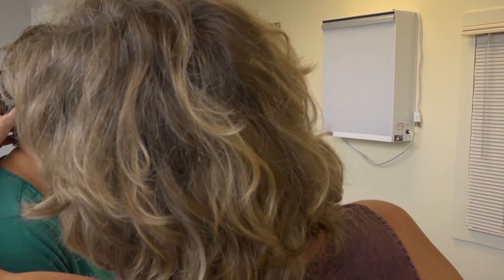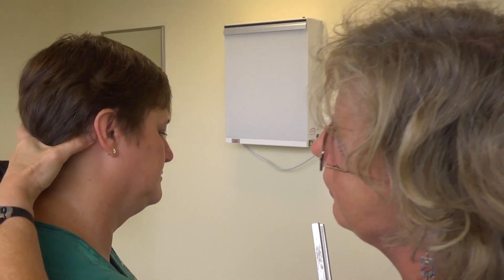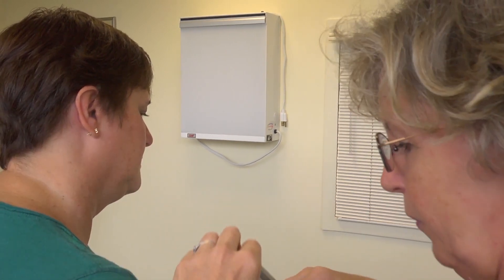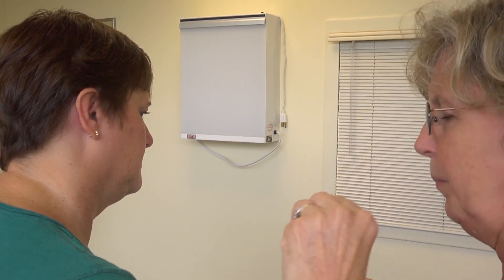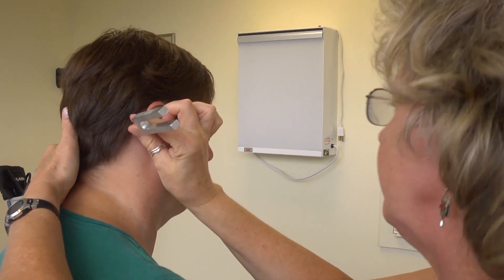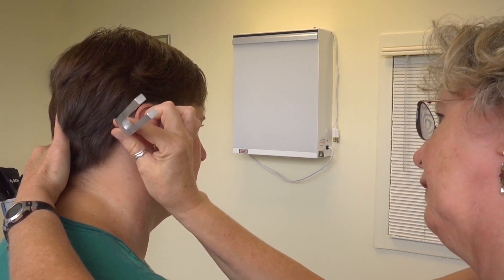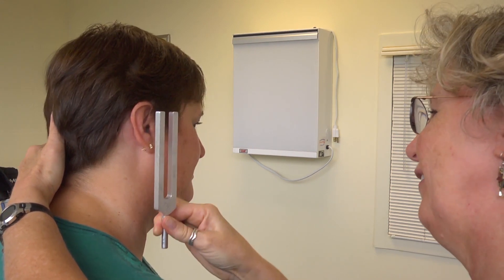For the Rinne test, place the tuning fork on the mastoid. This is also a time to check for any mastoid tenderness. Ask the patient if they can hear it, then tell them to let you know when they no longer hear it. Then move the fork to check air conduction — a normal finding is air conduction being greater than bone conduction. It can be timed, and air conduction should be twice the length of bone conduction. That's the Weber and Rinne.